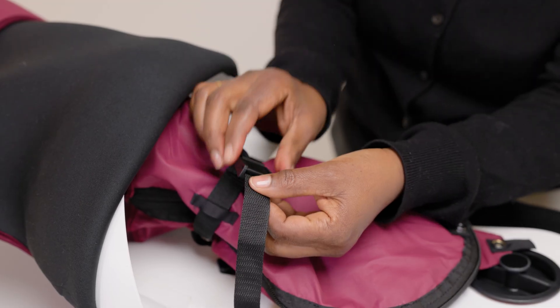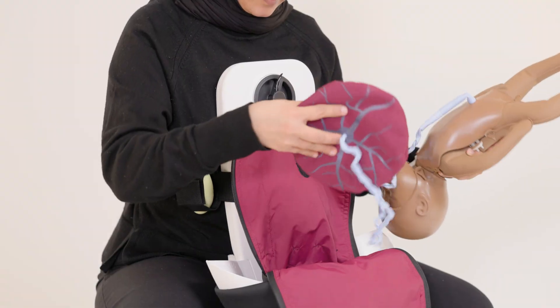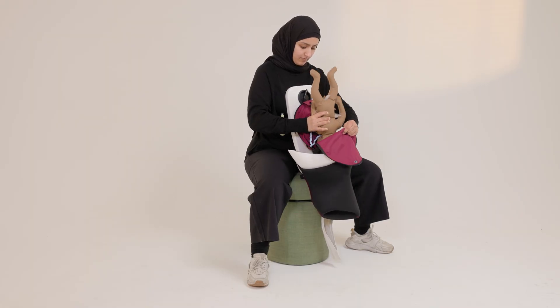Adjust the cervix ribbon to reflect the desired dilation. Attach the placenta to the hook and loop located inside the uterus. Insert Neonataly in the desired position.